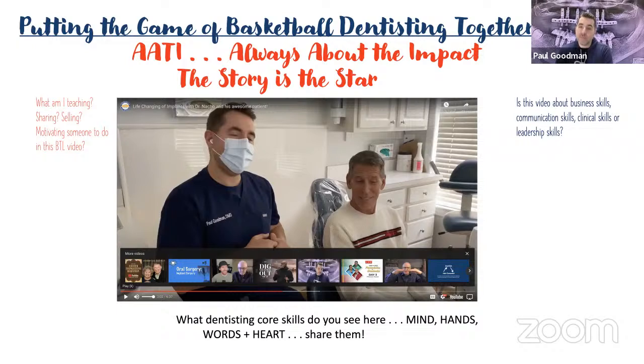That short-term denture, otherwise known as an immediate denture, I take that and I transform it by either using temporary cylinders on the fixed case or by picking up attachments on the removable case and make them a back-up overdenture. It is so valuable, backup removable or backup fixed. So plan into your case, whether it's accounting for the lab fee or having some small expense, make a backup set. It will help you many times as it's helped me.